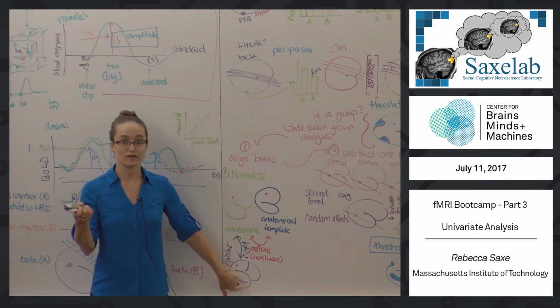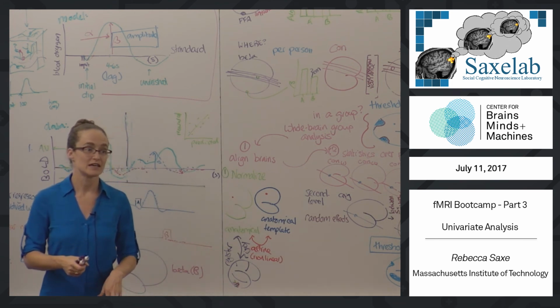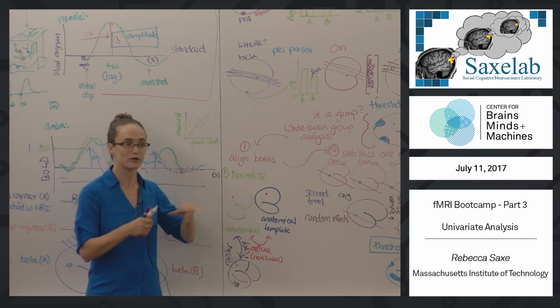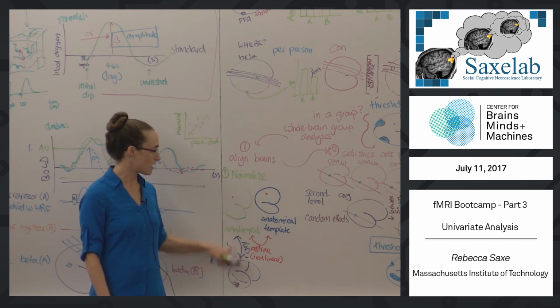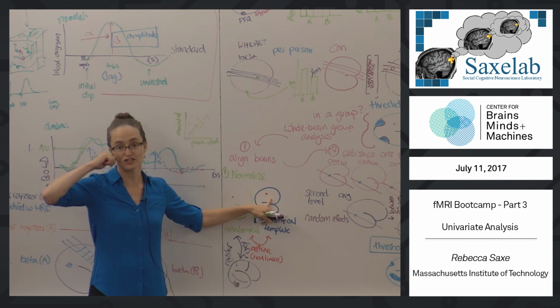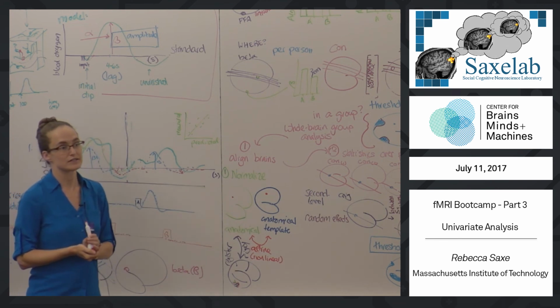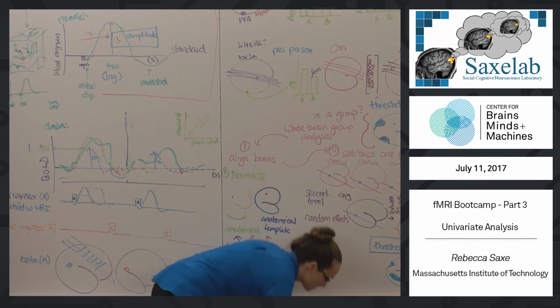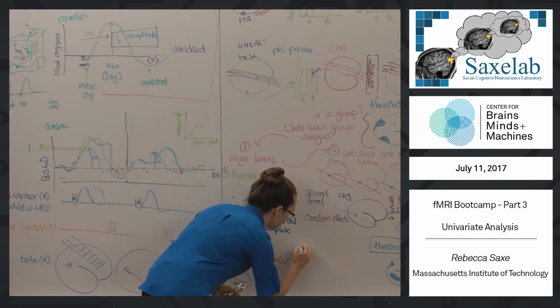Again, we know that's for sure for V1, and V1 is the easiest. As you go up to higher regions, you get less and less good alignment. And so that problem, you can improve it with better registration algorithms and better normalization algorithms, but you can't get rid of that problem. And so there's always been interest in not stopping with these two steps, but adding an additional step to use functional information to improve the alignment between subjects. And basically, there's two ways of doing that. They're very profoundly related, which I'm not going to talk about.